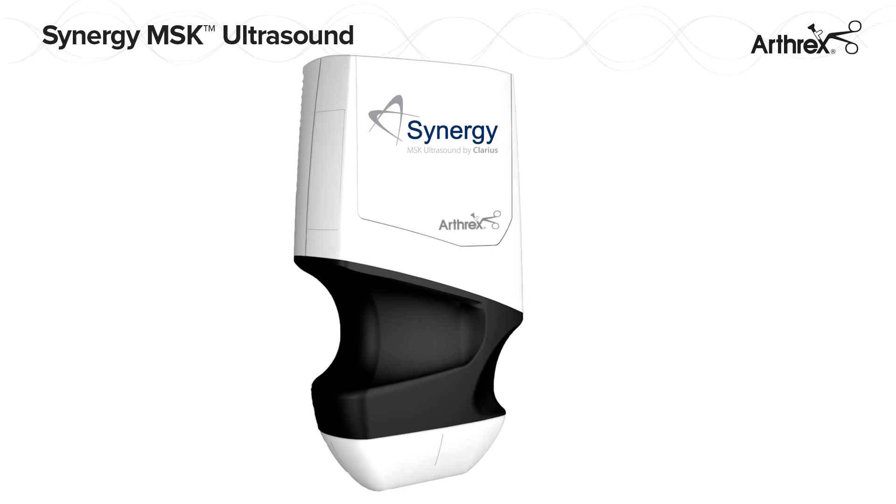Synergy MSK Ultrasound – Portable Wireless High-Resolution Ultrasound Imaging.